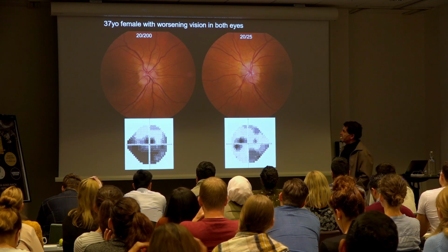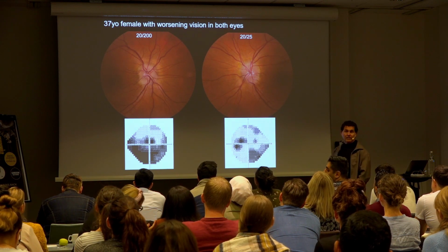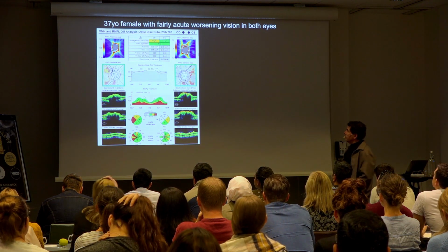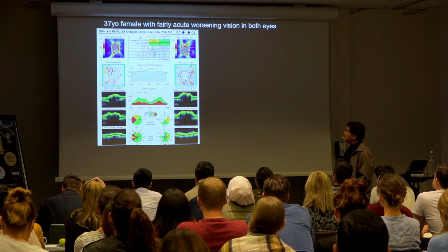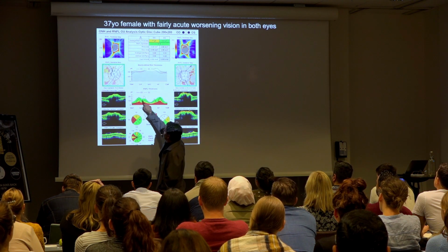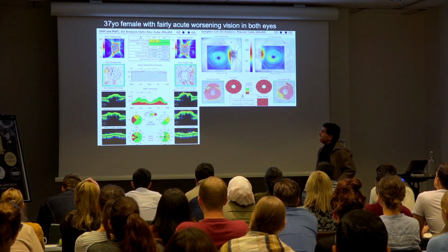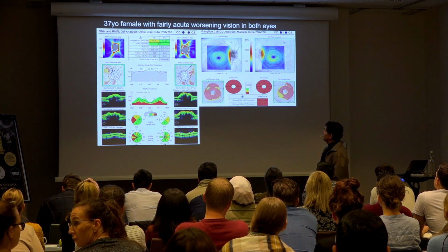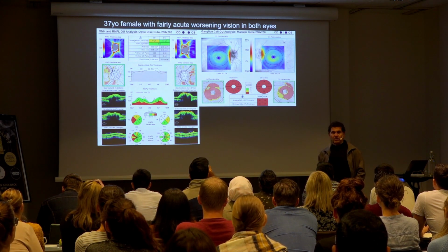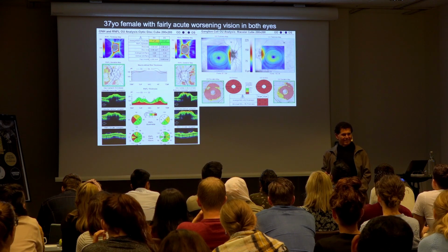And what would you say about the nerves in this one? Well, they don't look atrophic, they look a little swollen, don't they? And your OCT kind of confirms that, especially more so in the left. And the ganglion cell layer is going in the wrong direction, so that's really thin. So here's a situation again. These are the cases where you've got the combination of what looks like edema plus ganglion cell loss.